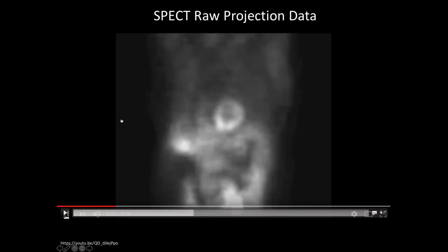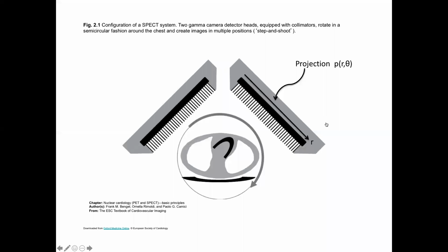The detector, remember, is a 2D array. So it has Y in this direction, X in this direction, right? No, don't use that, sorry. Let's call it something else. This is Z. Let's call this slice in this direction. And then this along here is that R direction along the detector, okay? Let's go back and look at that detector here, the R direction here.